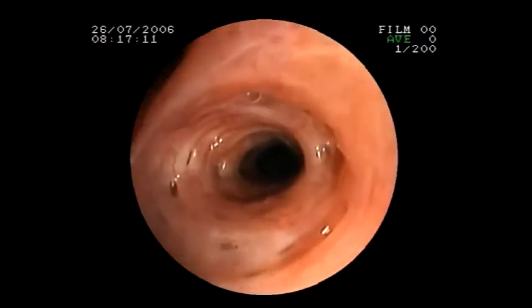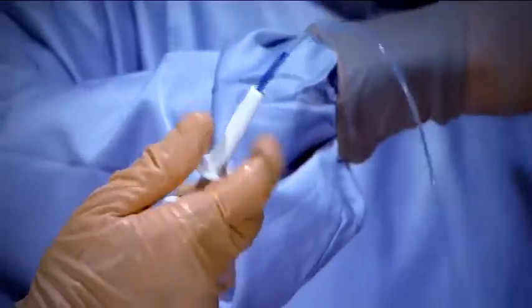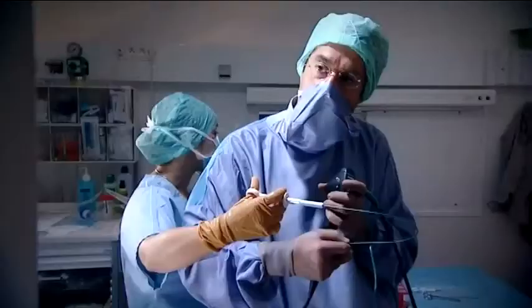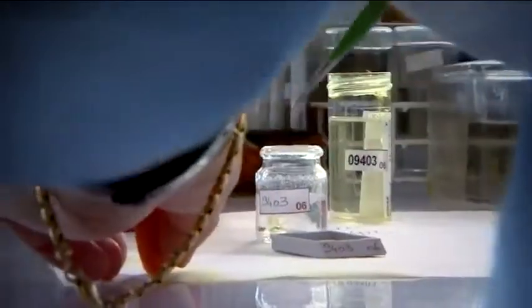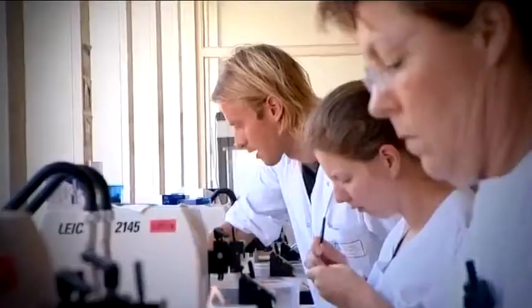Standard bronchoscopes cannot reach the distal lung, and obtaining biopsies can be risky. Even when samples are safely taken from the patient's body, histology cannot provide functional or dynamic information.